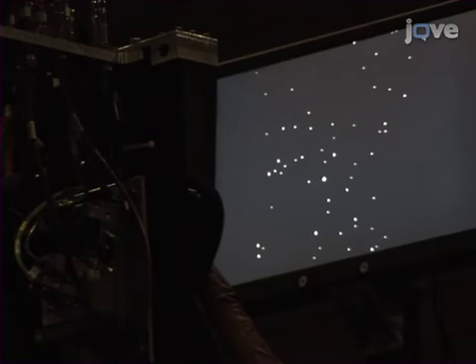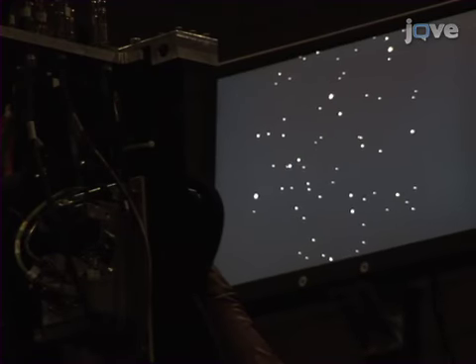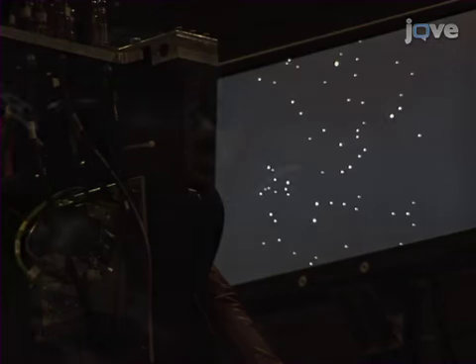To create parallax between optic flow and motion, the dots deeper in the field of view are drawn smaller. Regardless of the participant's movements, each dot is shown for 2 seconds asynchronously before it is randomly reassigned. Thus, a total of 100,000 dots move every second.